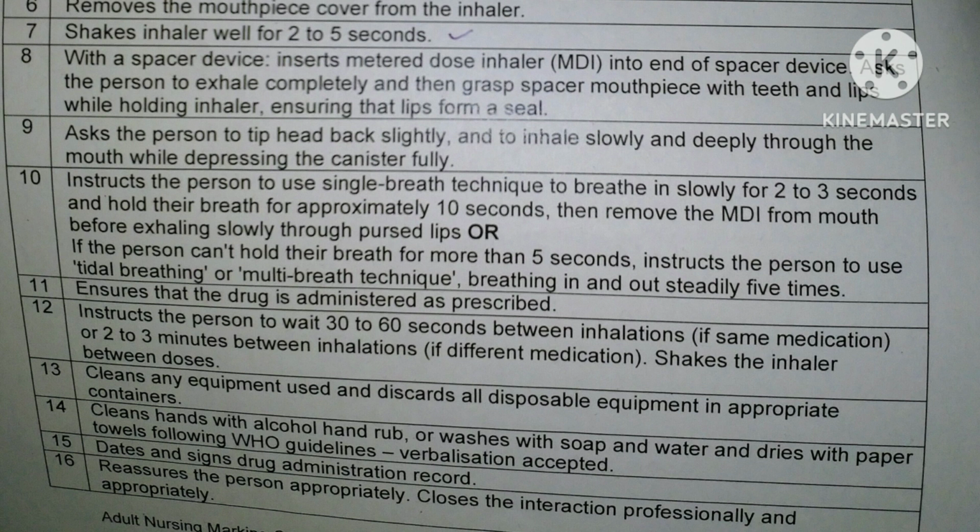Next step, clean any equipment used and discard all disposable equipment in appropriate containers. Clean hands with alcohol hand rub or wash with soap and water and dry with paper towels following WHO guidelines. Even verbalization they will accept. Then date and sign the drug administration record. Then reassure the person appropriately and close the interaction professionally.